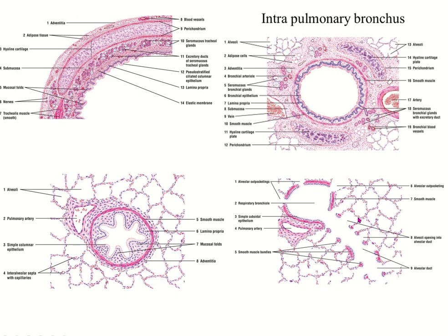And this is alveoli. Alveoli is formed by three types of cell. Type 1 pneumocyte, simple squamous like flattened cell, which is responsible for the gaseous exchange. Type 2 pneumocyte, simple cuboidal like shape, and it secretes surfactant, which reduces the surface tension. And it also contains alveolar macrophage, which removes the pathogen entering with the air.